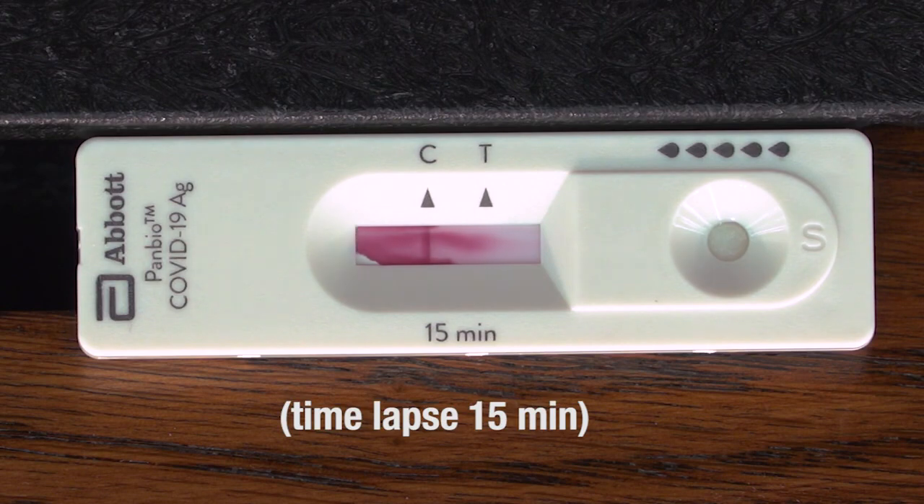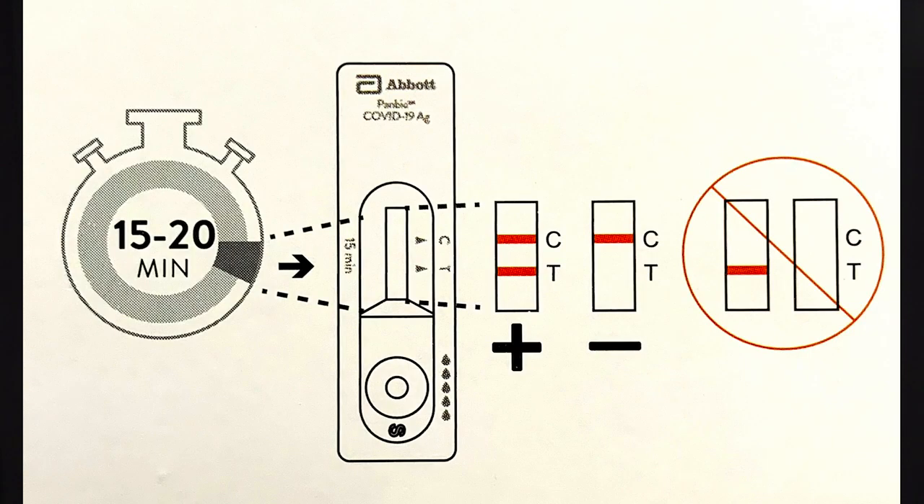Now we have my result — I'm negative. One red line under the C is a negative result. A red line under the C and under the T is a positive result. One red line under the T is an inconclusive result. Both the nasal swab and the NP swab work in the same manner. Anyone with a positive result or an inconclusive result are legally required to isolate and must leave the worksite immediately. These individuals should seek a confirmatory test at an AHS assessment centre. If they test negative at an AHS assessment centre, they are allowed to return to the workplace.